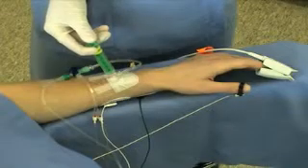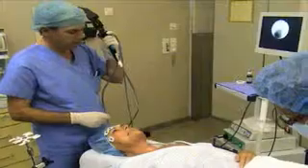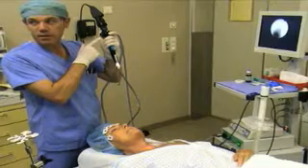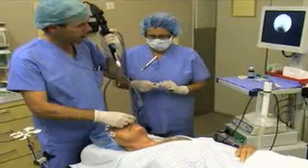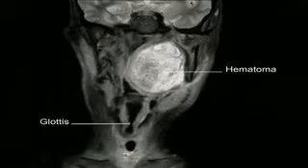The administration of a hypnotic before advancing the tube in patients without a severely compromised airway increases patient comfort and may also decrease the reluctance of an anesthesiologist to perform fiber optic intubation in an awake patient. After the patient loses consciousness, advance the instrument towards the carina. If the patient has a severely compromised airway, do not give any sedating medication, even for the insertion of the fibroscope.